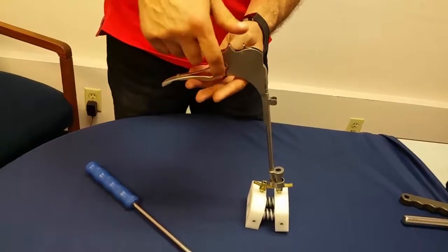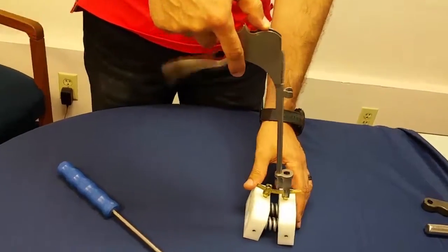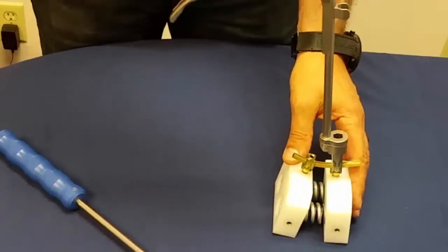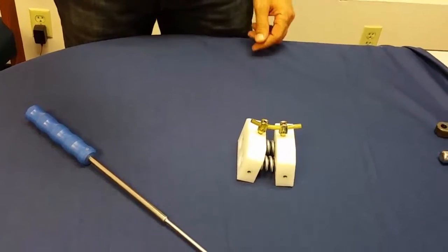Remove the provisional driver, pull on the lever, make sure that the reduction ring has been retracted fully and remove the reduction instrument.